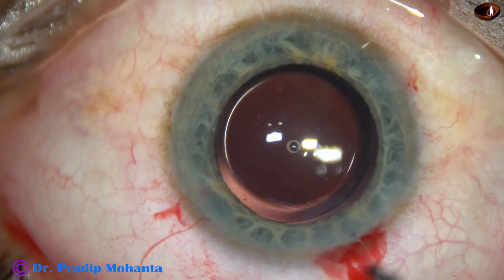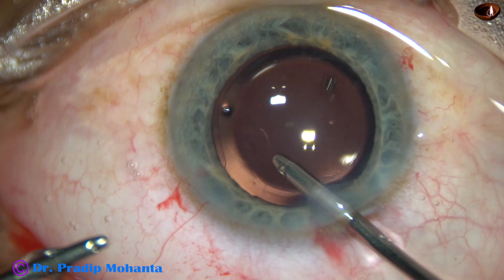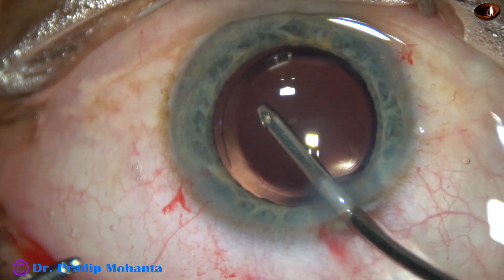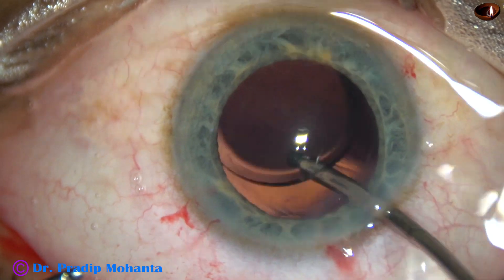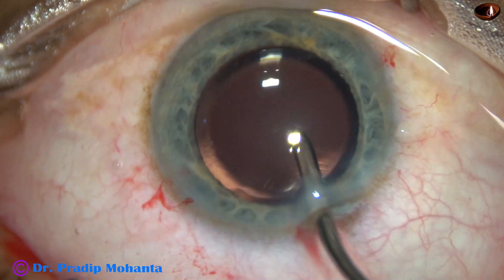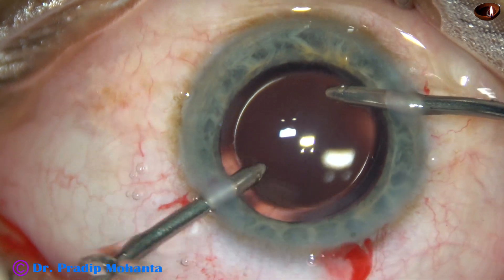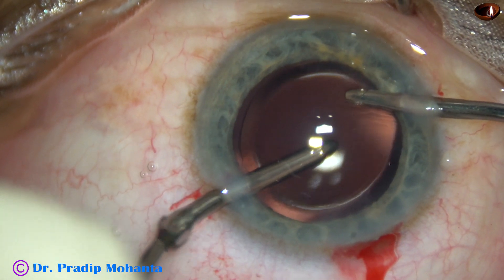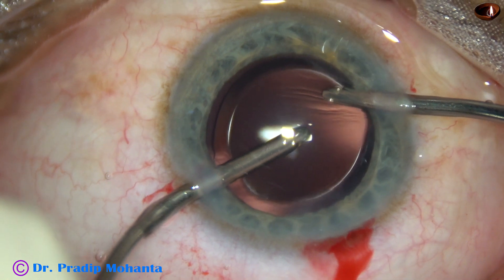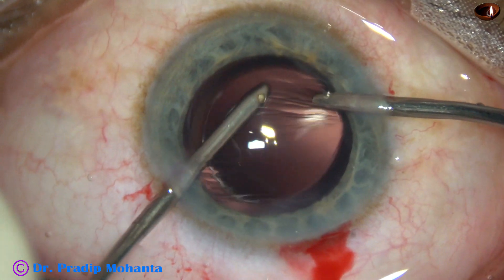And now, thorough cleaning of the viscoelastic is done. The anterior chamber is irrigated very nicely, so that most of the visco comes out just by irrigation. The anterior chamber angle is irrigated, and then the lens is pushed a little downward, and the capsular bag is irrigated very nicely. The irrigating probe goes behind the intraocular lens and irrigates the capsular bag. Most of the visco from the capsular bag comes out through irrigation. Now, irrigation and aspiration is used together to remove the last portion of the visco.